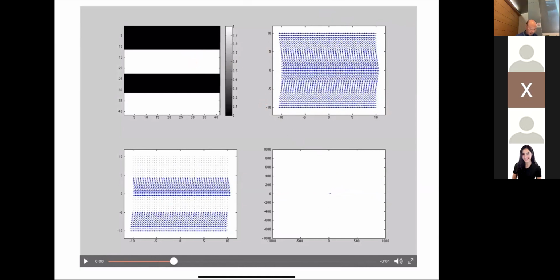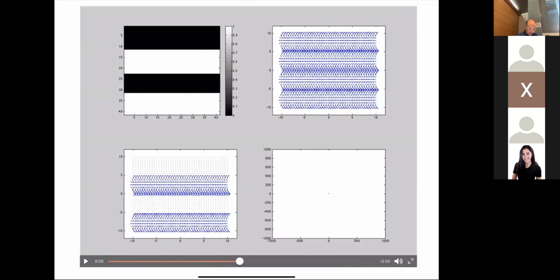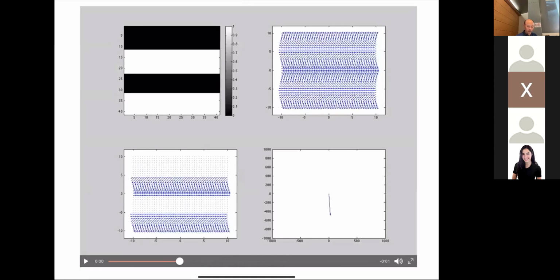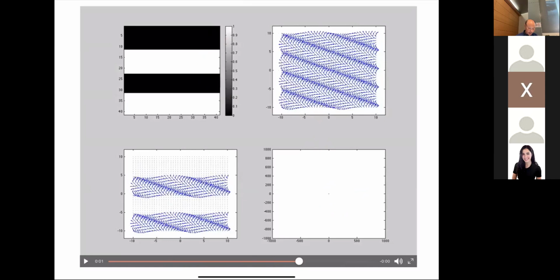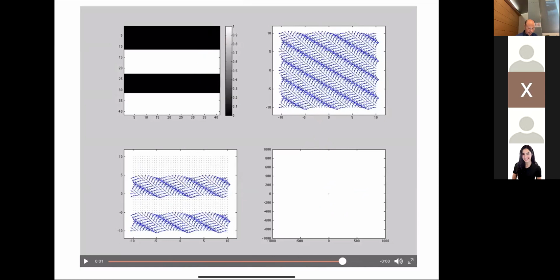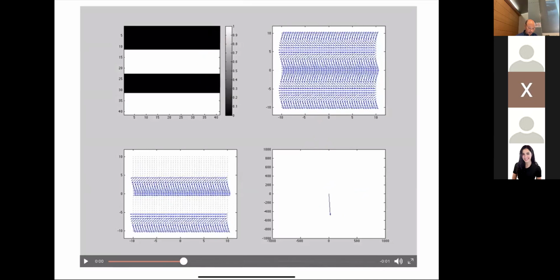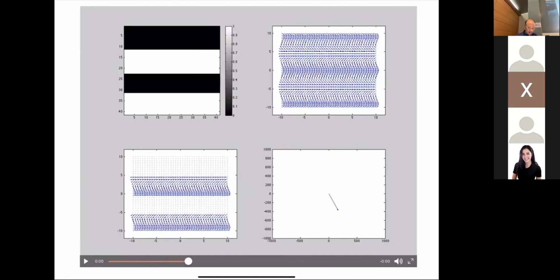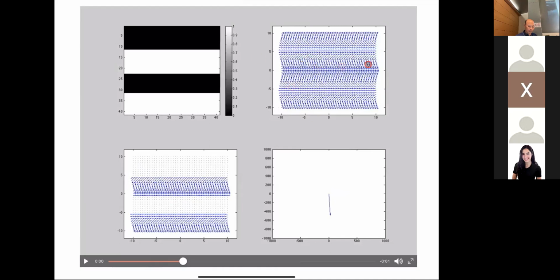So let's just keep going until that thing gets bigger. Where does it get big again? Okay, we must have missed it. Here's where it seems almost as big, right? And so you can see here that this spatial pattern is looking like it might be a good match for this object, right? So then that summation gets big again. And then it gets small, and then it stays pretty small because none of these other stripy phasor patterns is a good match for my object, okay? Oh, wait, there it is. No, that's the beginning. So the beginning is big, and then somewhere where I've got something almost vertical is big, okay? So you can play with this on your own and see that, all right?